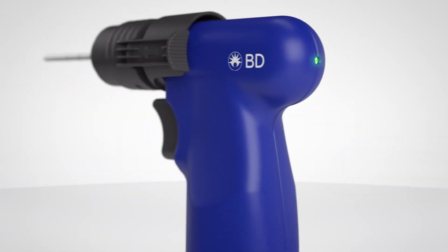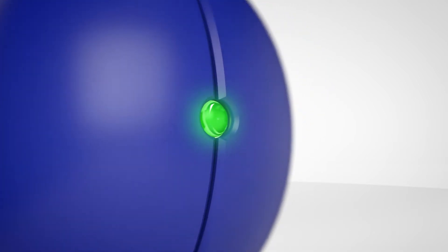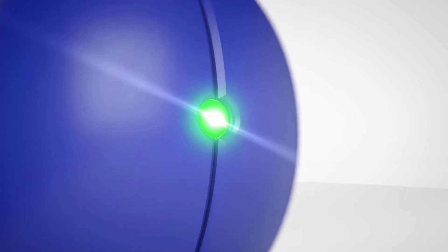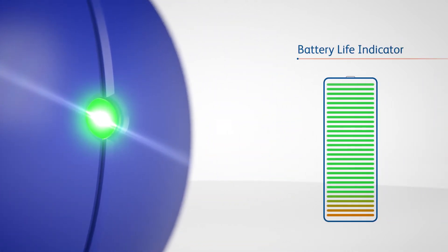An LED indicator displays driver speed and battery level. The LED brightness indicates the relative speed of the power driver. Full brightness indicates that the driver is operating at maximum speed.